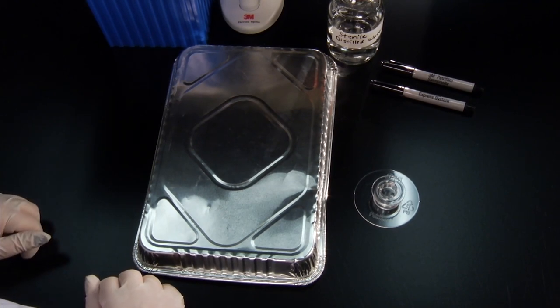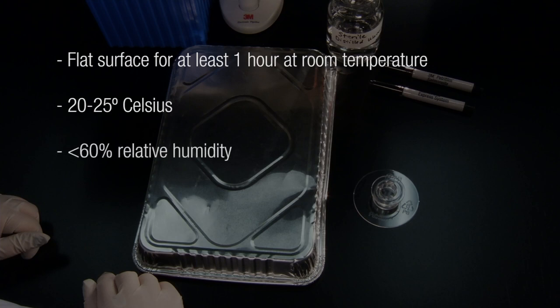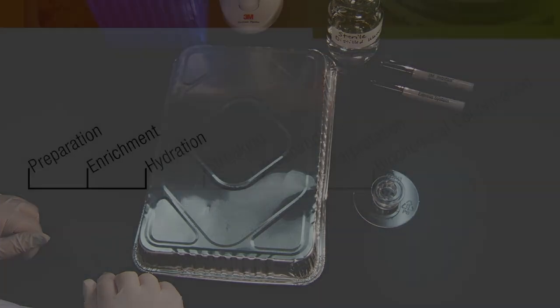Place the 3M PetriFilm Salmonella Express Plate on a flat surface for at least 1 hour at room temperature, 20 to 25 degrees Celsius and less than 60% relative humidity, protected from light to allow the gel to form. An aluminum foil tray is being used here.